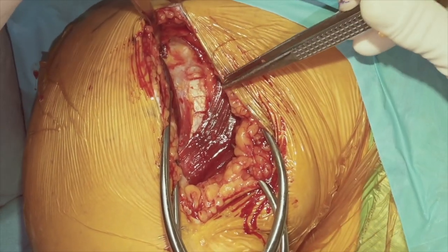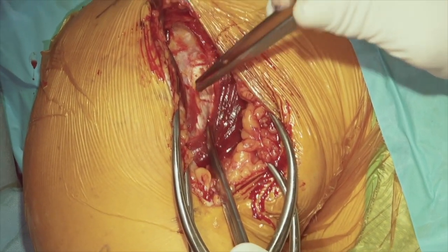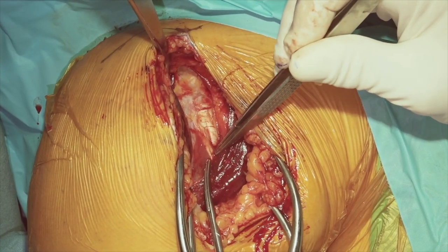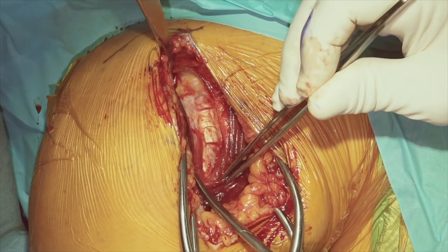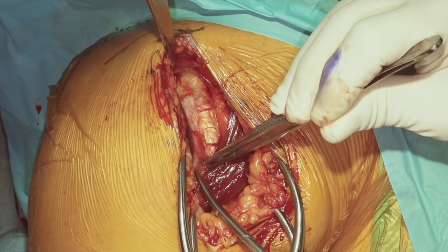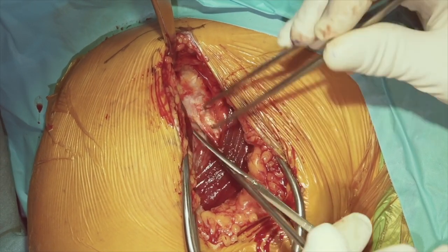Once we're down to the inferior border of the pectoralis major tendon, we'll again identify the coracoid process. We see the coracobrachialis, and then lateral to that is additional fibrous tissue related to the short head of the biceps. Lateral to that is the red tissue or muscle of the short head. We refer to this as the white stripe and the red stripe, and we'll go just lateral to that red stripe to go through the clavipectoral fascia to proceed through our next layer.